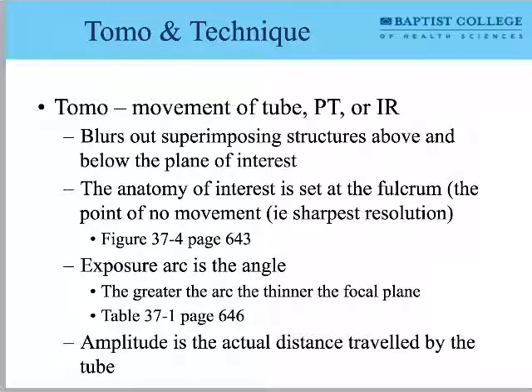And then they have some way of calculating exactly where the kidneys are at, right? They say that it's a third of the distance across the abdomen or something like that, right? Because they're basically retroperitoneal, right? So just know that when you get to a facility, if they're using the tomo unit, ask them, okay, how do we set the fulcrum point on this machine? And you'll know enough to sound like you know what you're talking about.